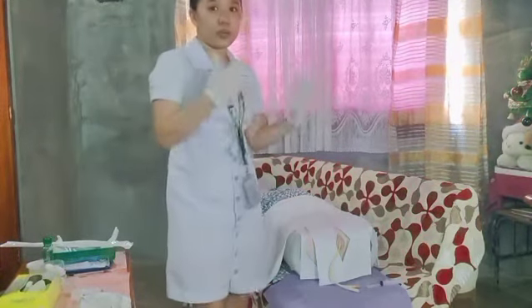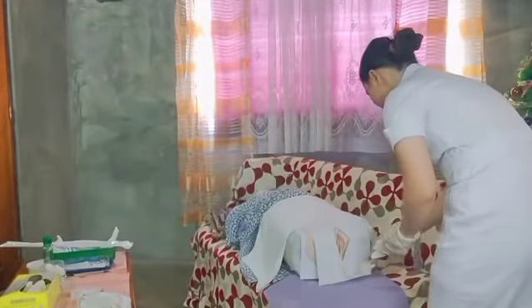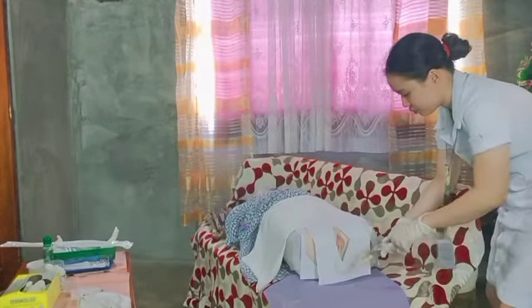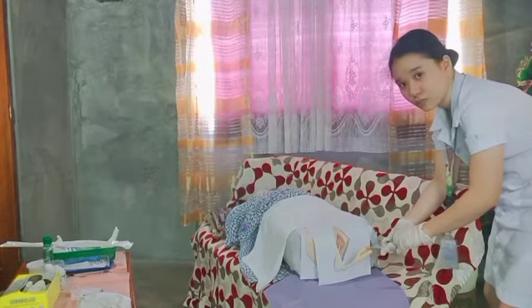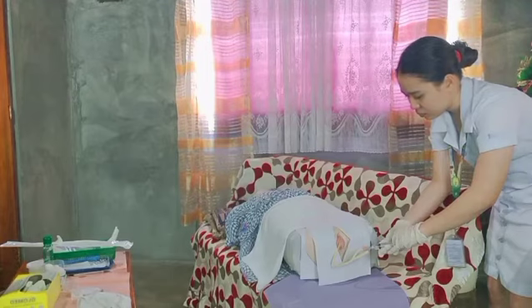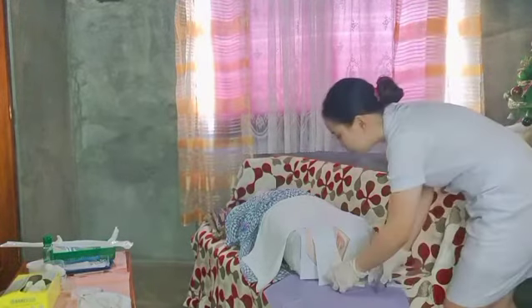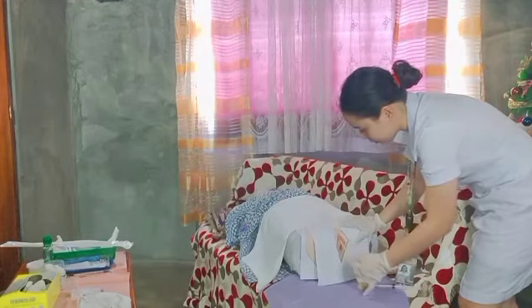So, we're going now to inflate the balloon. Amilain ko lang po saglit ha. Okay.